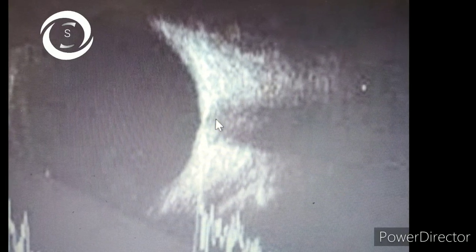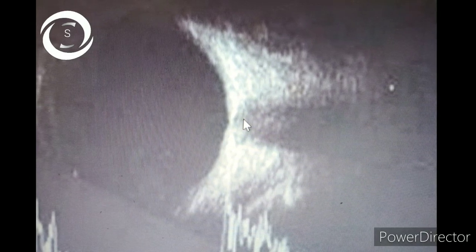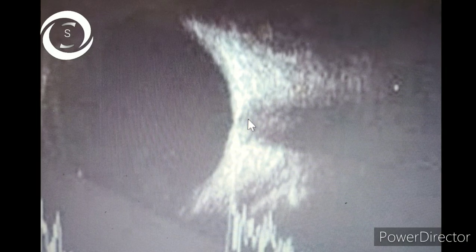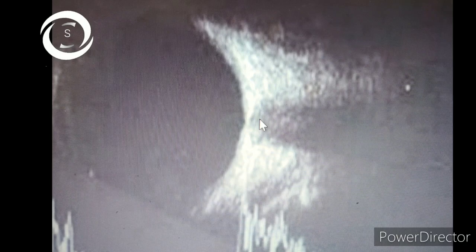In an ideal B scan, the optic nerve is visible. You can look at the optic disc for disc drusen, disc cupping, raised disc in disc edema, then enlarged optic nerve in optic neuritis, papilledema, and optic nerve tumors. You can see retinal tumors like retinoblastoma with calcifications, choroidal tumors like melanoma and choroidal hemangioma, then kissing choroids, choroidal detachment, and posterior scleritis with a characteristic T-sign. Enlarged extraocular muscles can also be appreciated.